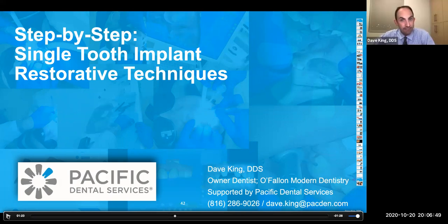So we demonstrate it, and it takes a little bit of new training. Most implant crowns, when you floss, you're going to floss down and then under the crown, gently down under the gums. You're not going to create bleeding intentionally, but sometimes they will bleed a little bit, and if they do, we want to know.